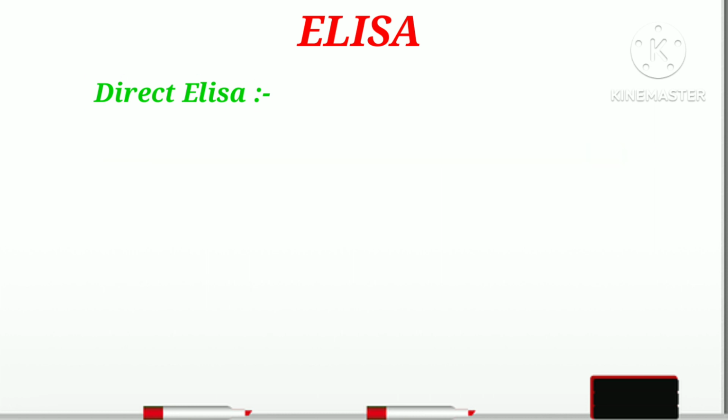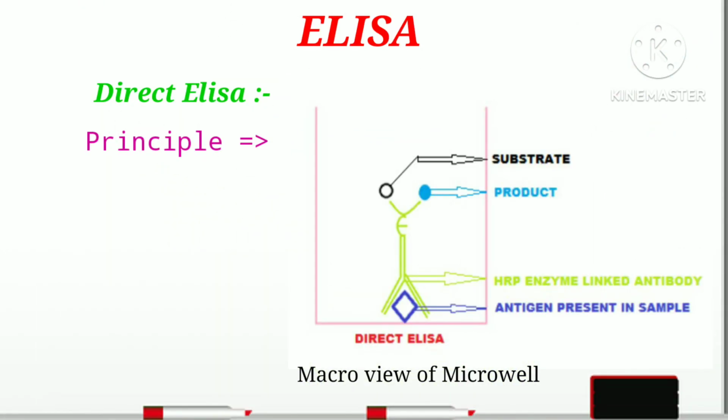What is the principle of direct ELISA? In the microtiter wells, first we add patient sample which contains antigen of interest. After adding sample, we add enzyme conjugate. Enzyme conjugate is horseradish peroxidase linked monoclonal antibody.